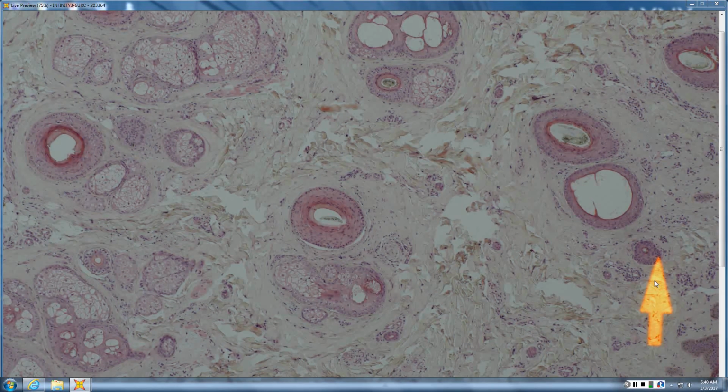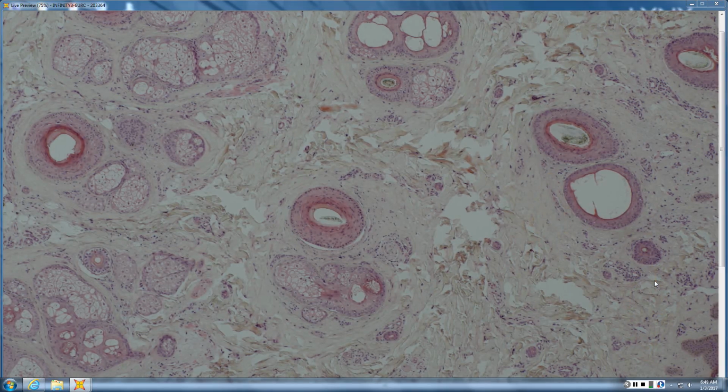None of that really matters, except to point out that you can measure the hair shaft diameter to tell whether it's terminal or vellus, but you don't need to, because you can just see how tiny that is when you compare this to this guy here. This is a remaining terminal hair, but almost all of these are tons and tons of really small hairs.